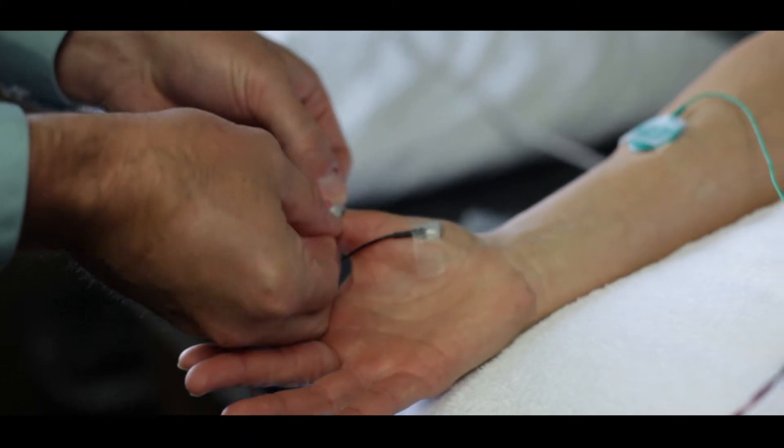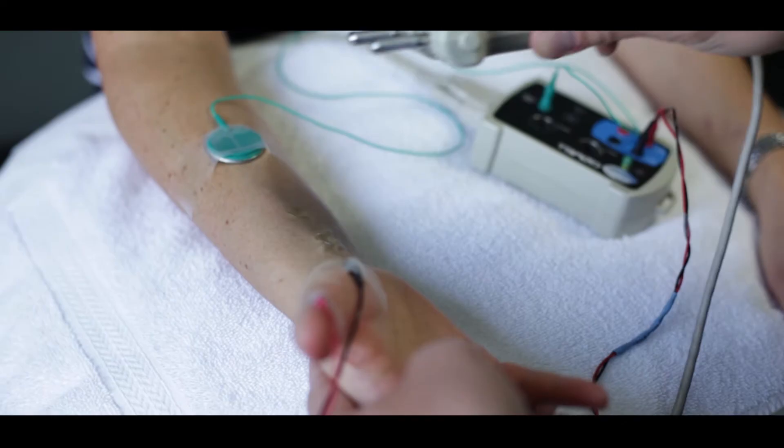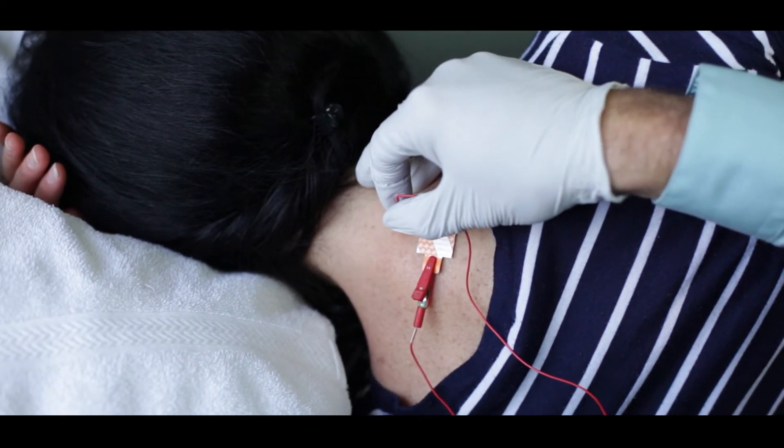Electrodiagnostic testing is considered the gold standard test to investigate for nerve injury or nerve pathology. It is comprised of nerve conduction testing, which measures your nerve conduction velocity and peripheral nerve responses, as well as electromyography or EMG, which utilizes a fine needle electrode that is placed inside of the muscle in order to record its electrical activity.